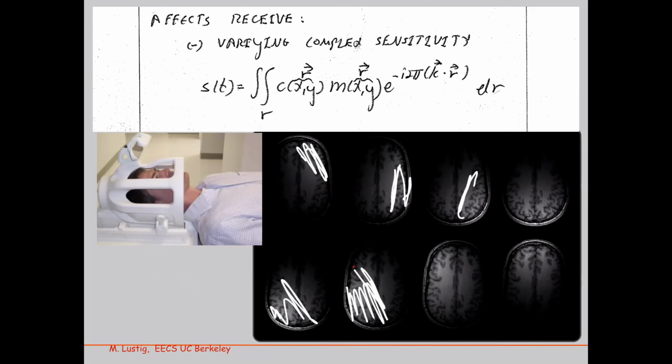Well, ask a patient who needs to lie still for, I don't know, 3 minutes. Now they only need to lie still for a minute and a half for a single scan. So that could be significant. What about a full exam that's supposed to be an hour, and now it's half an hour? A factor of 2 is really significant. And it can be used for other things.